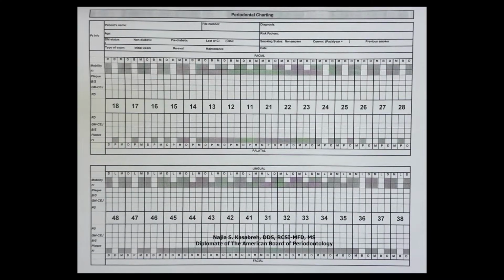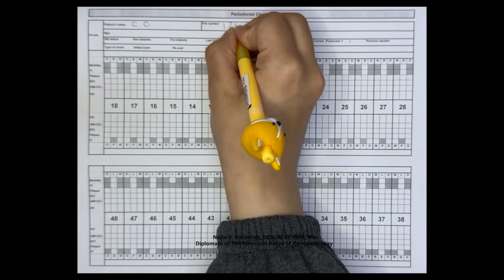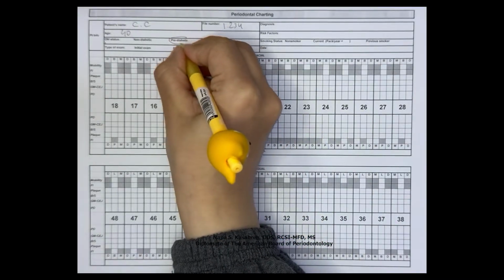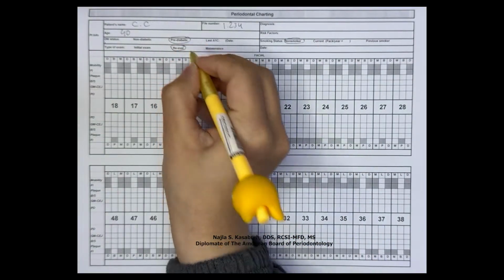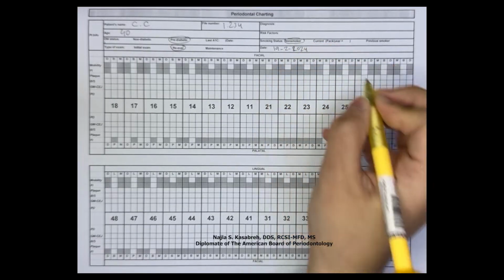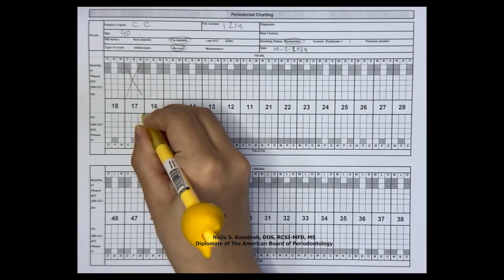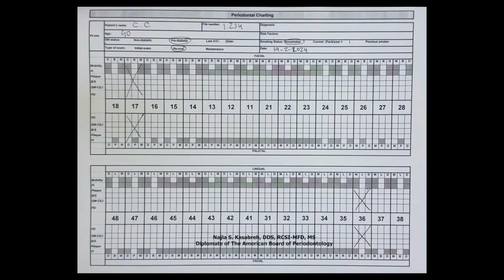Begin by documenting the patient's name, file number, age of patient, smoking and diabetic status, type of exam conducted, whether it is an initial exam, a re-evaluation, or a maintenance exam. Don't forget to record the date of examination as well. Next, cross out any missing teeth, and record the presence of implants.